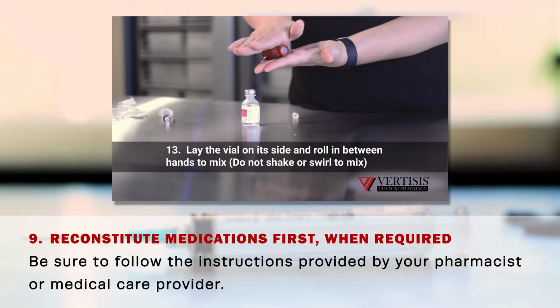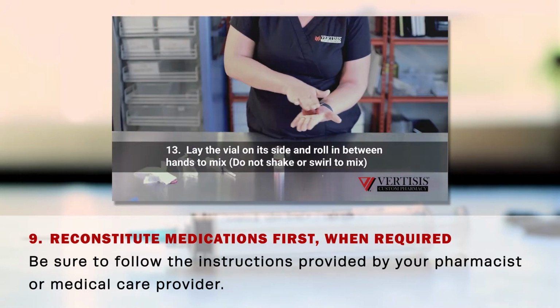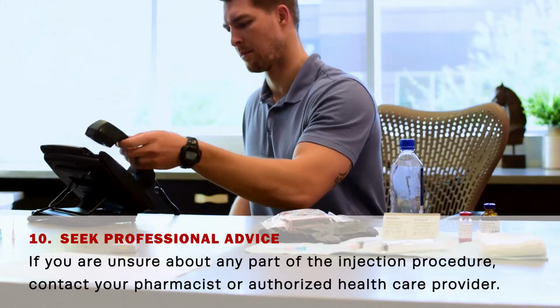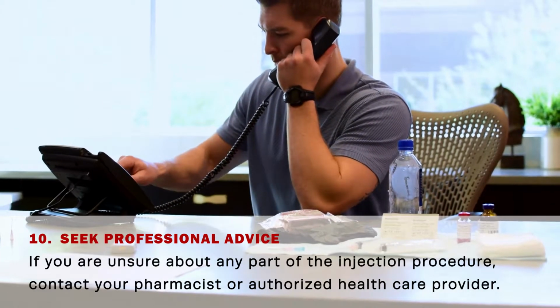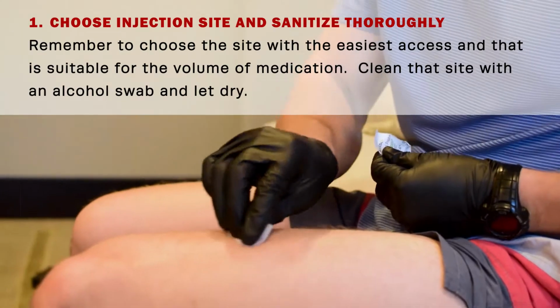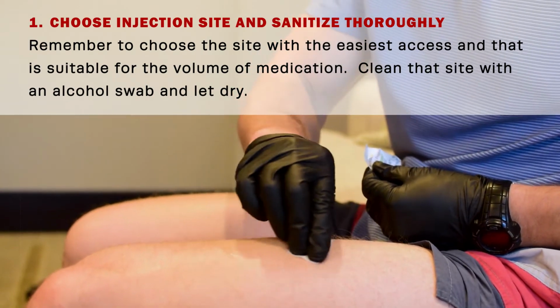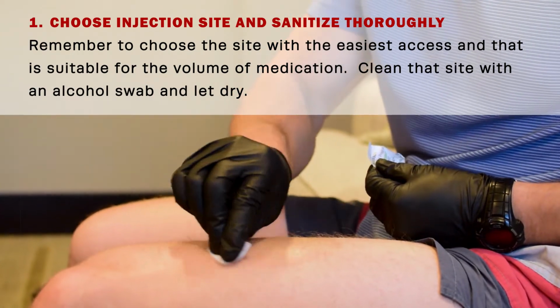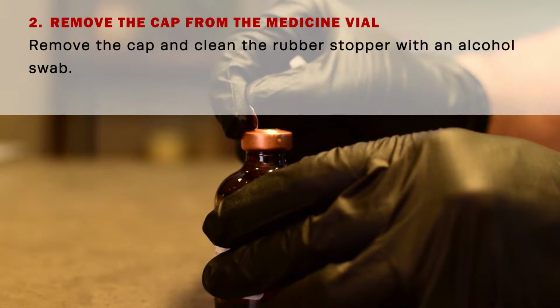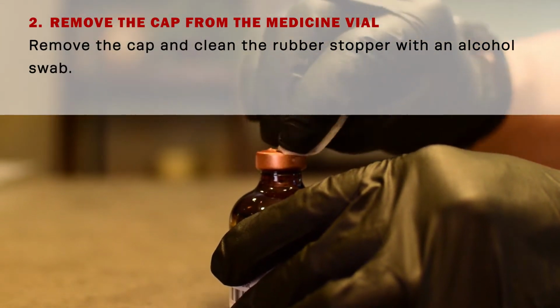Some medicines will require reconstitution prior to use. Always follow the instructions provided by the pharmacy and/or your medical professional. Seek professional advice if you're unsure about any step. Choose your injection site and clean the chosen injection site with an alcohol swab. Remove the cap from the medicine vial and clean the rubber stopper with an alcohol swab.